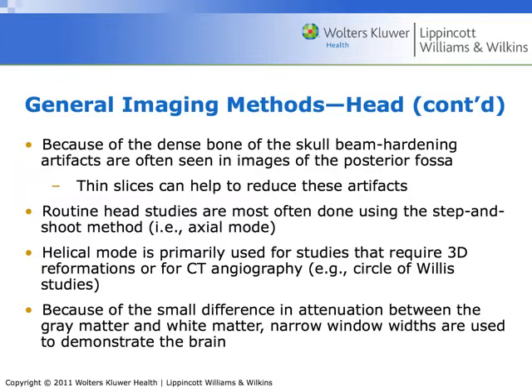So it's important for us to evaluate the images after the exam and make sure that, if we need to, we may have to scan through that again. We used to do butterflies through that area, where we would tilt the gantry to account for certain kinds of beam hardening artifacts, particularly like a spray artifact from teeth.